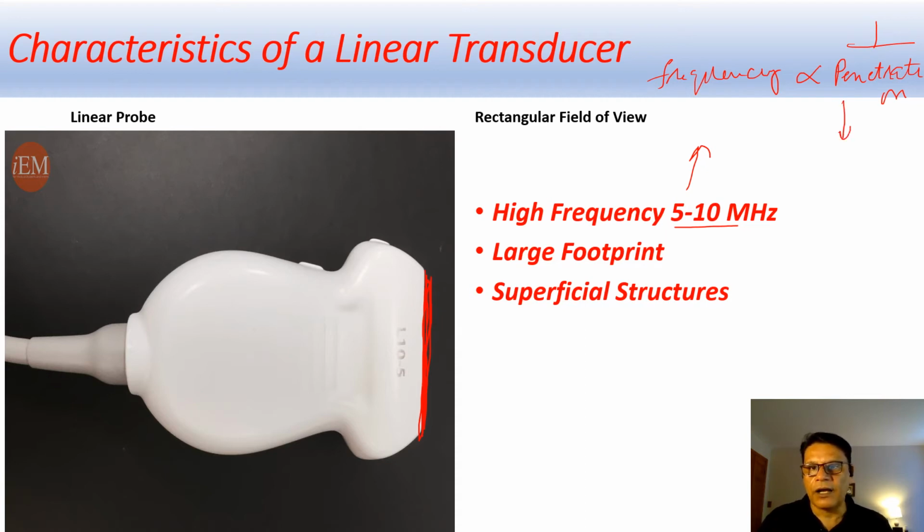It means high frequency cannot go deeper inside the body. So this is the limitation of high frequency.